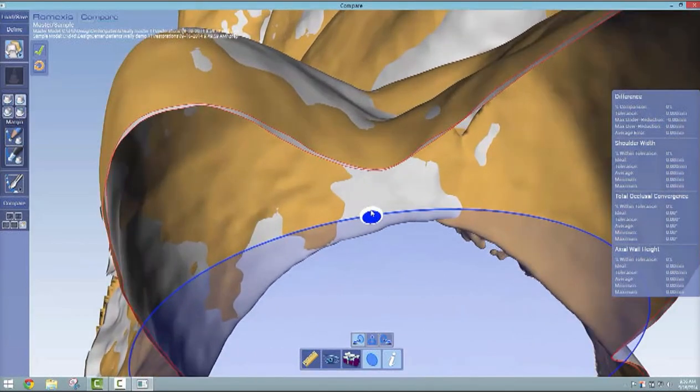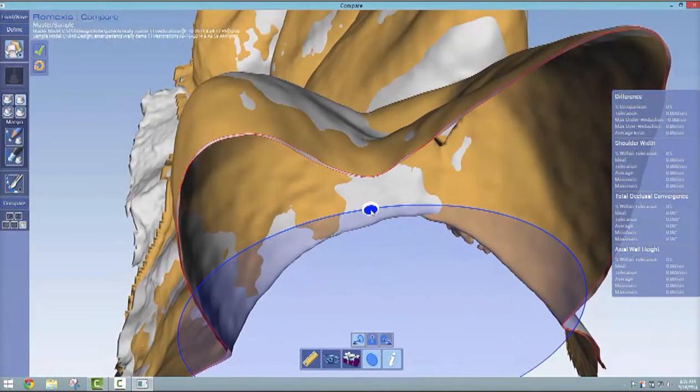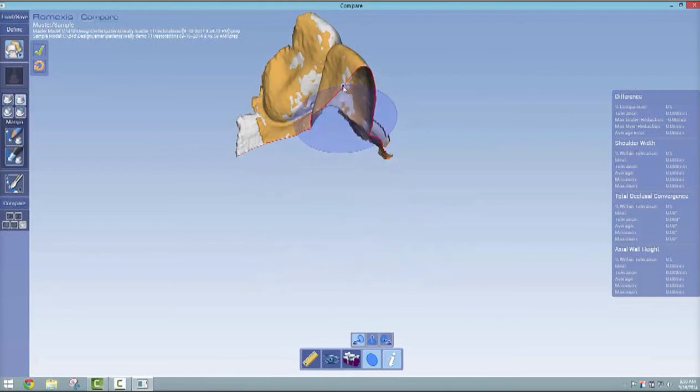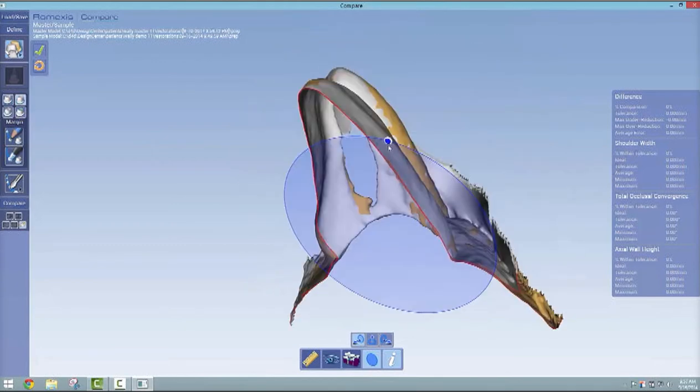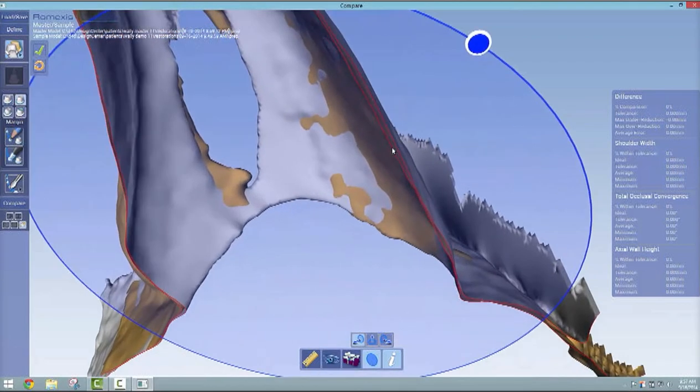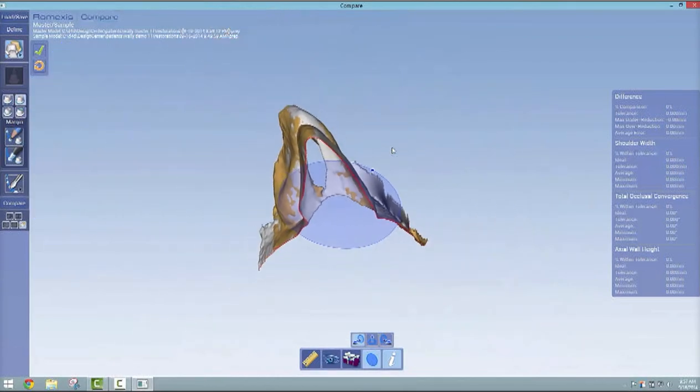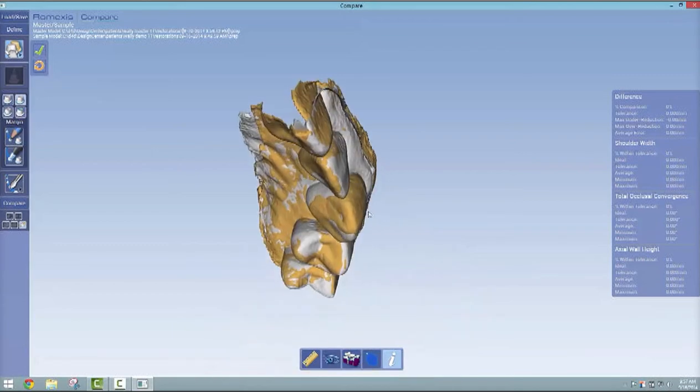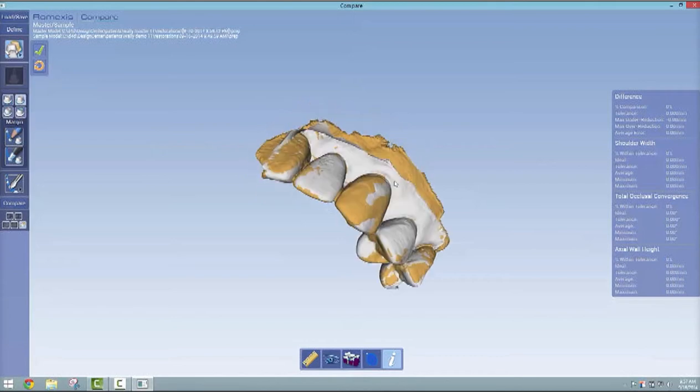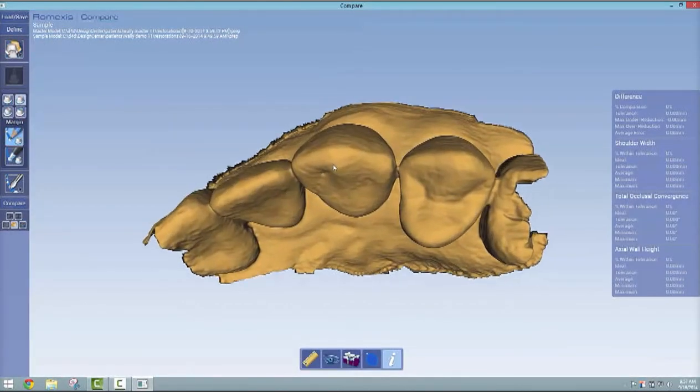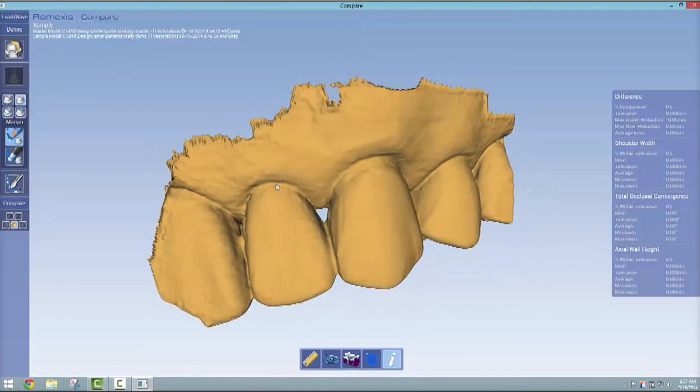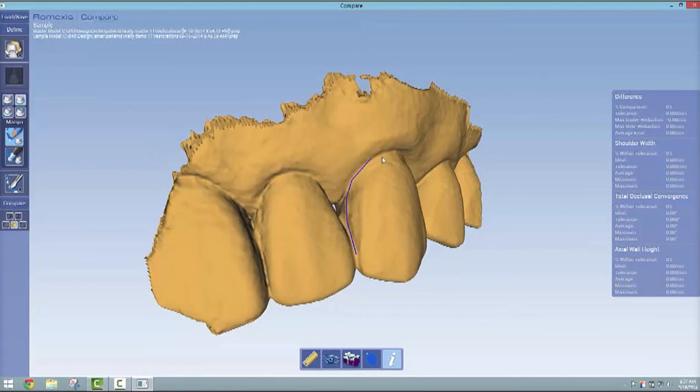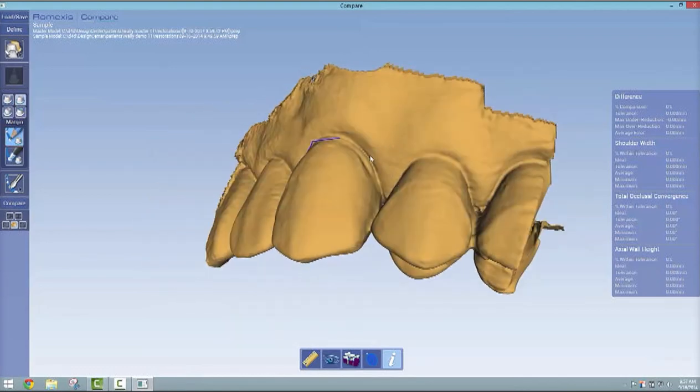We can check, but I usually don't. You could slice it and see how close those two different models are on the adjacent teeth. We're pretty close here, almost indistinguishable, so we're good. Once you've verified that, I usually just skip that slice step after doing a lot and find it's usually pretty good anyway. Mark your margin by going to the trace finish line tab.